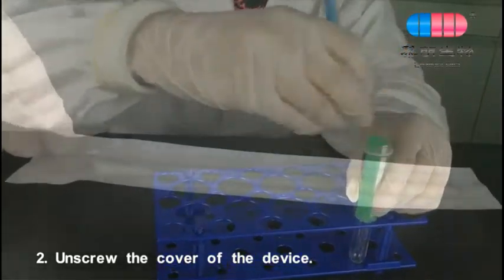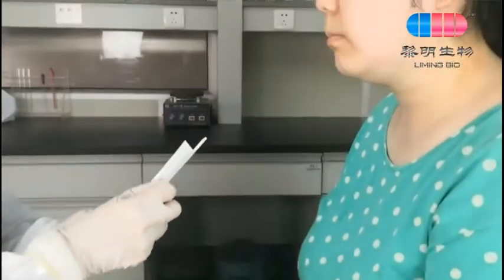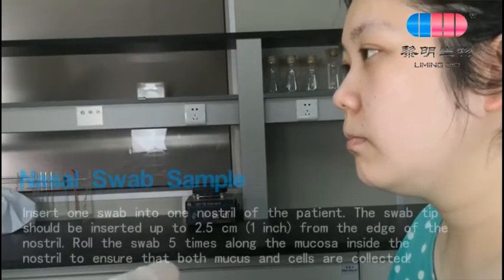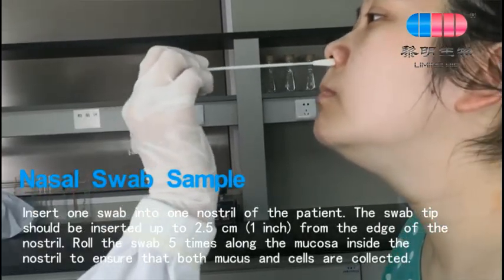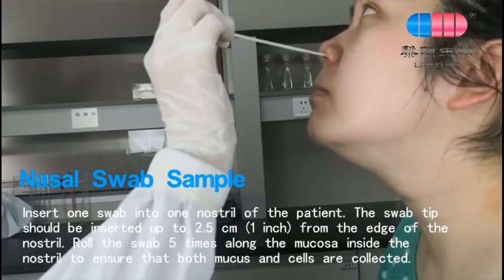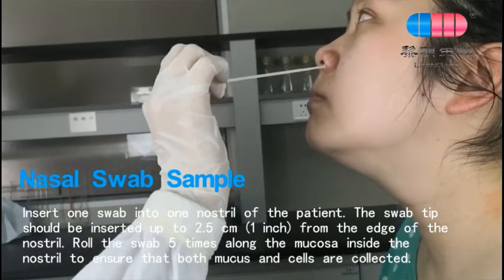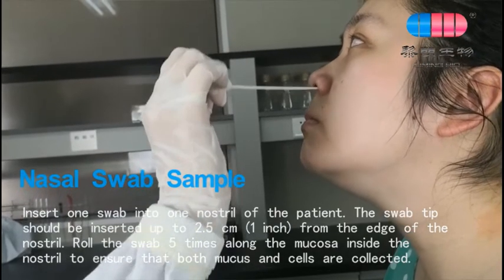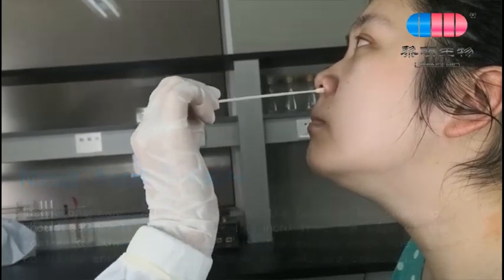Unscrew the cover of the device. For a nasal swab sample, insert one swab into one nostril of the patient. The swab should be inserted up to 2.5 cm from the edge of the nostril. Roll the swab five times along the mucosa inside the nostril to ensure that both mucus and cells are collected.